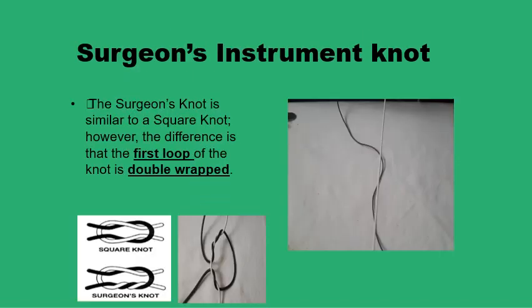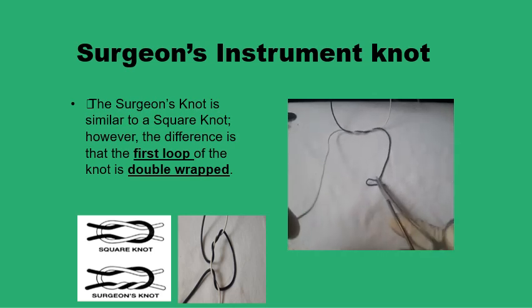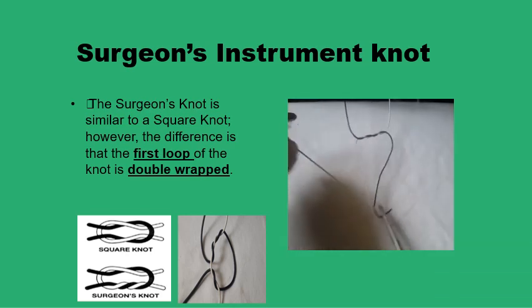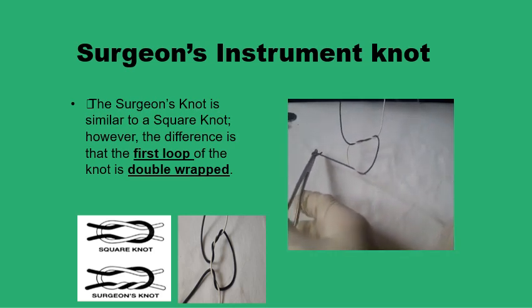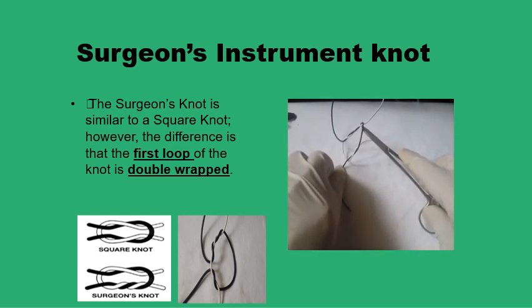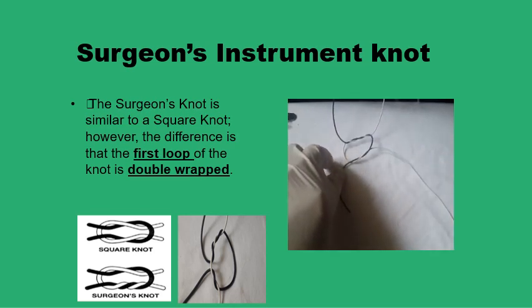In the square knot, the two ends of the suture wrap around each other once to form the first half-reef, and another time to form the second half-reef. In the surgeon's knot, you have a double wrapping on the first half-reef, and then just a single wrapping afterwards. To demonstrate using an instrument: we've wrapped the white twice over the black strand, then reverse direction — rather than working above, work below — and form the second half-reef knot with the white ends coming up on the same side of the black loop. This is a secure surgeon's knot, with the first half-reef double wrapped and the second half-reef a single wrapping.